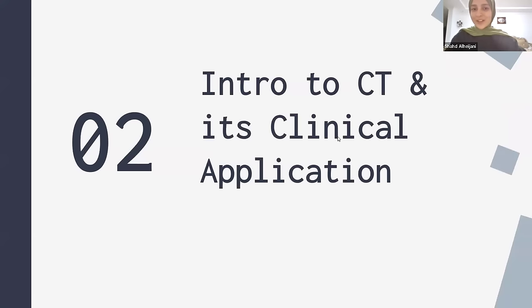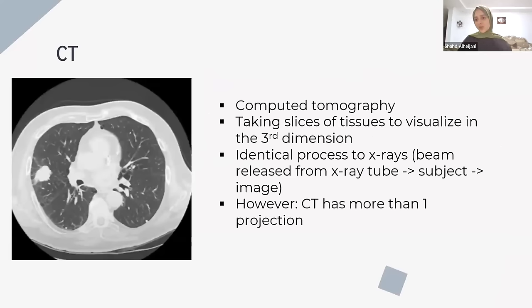Okay, so we're back with section two. Everything about CTs, basically. Introduction to CTs and their clinical application. So let's start with introducing what CT is. CT stands for computed tomography. So what is happening here is basically you're taking slices of tissue to visualize in the third dimension.